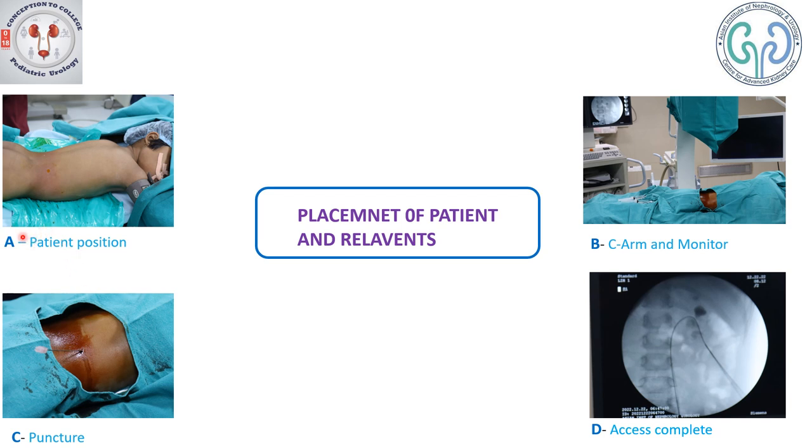Here is the position of the child. The child is placed in prone position after placement of the ureteric catheter. You could choose to use a bolster underneath, but here we chose not to use the bolster. Once the patient is positioned in prone, this is how the C-arm is placed over the patient with its monitor. Here is a monitor of the scope, and once positioning is done, this is how the puncture site has been chosen.